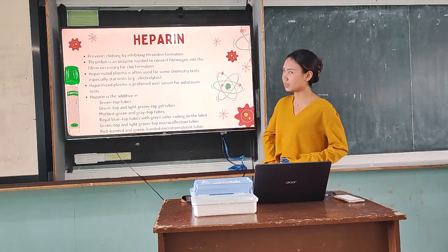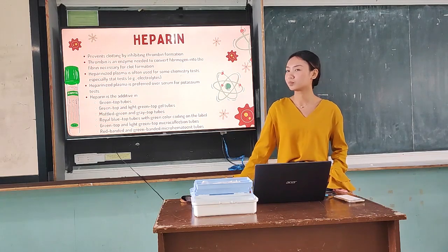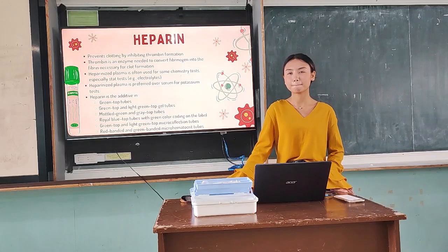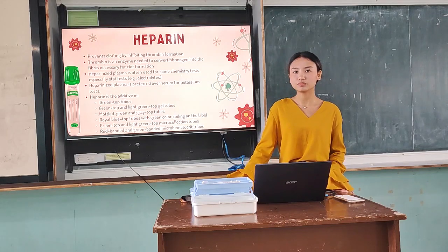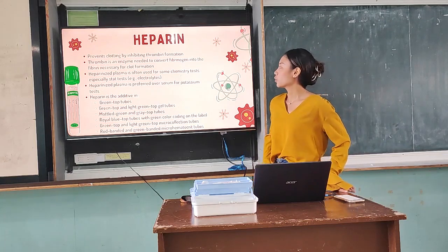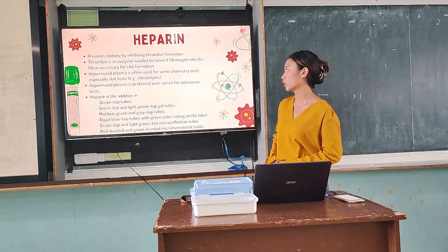So, again, ano na pala ulit ang stat test? When you say stat? Anyone? Yes, Mr. Manalo? It means that we need the specimen immediately, ma'am. Very good. Immediate, stat. So heparin tubes or the green tops are usually used for chemistry tests.